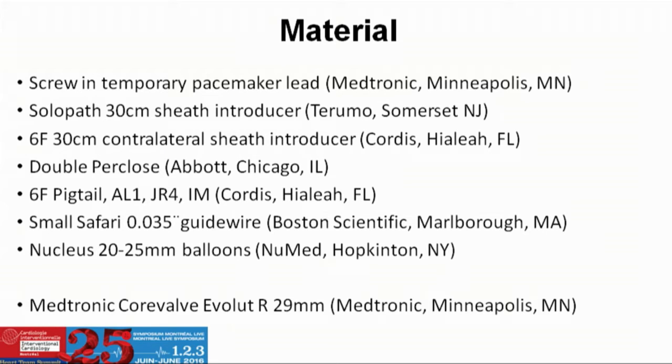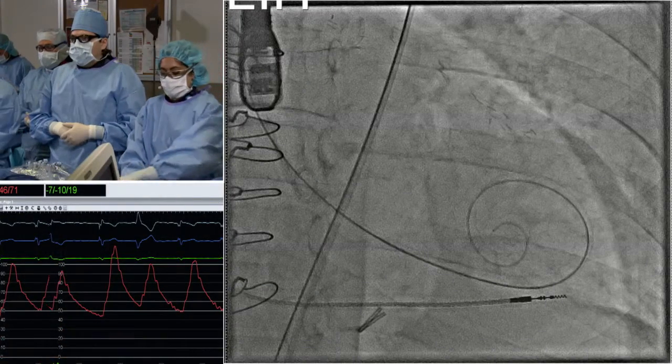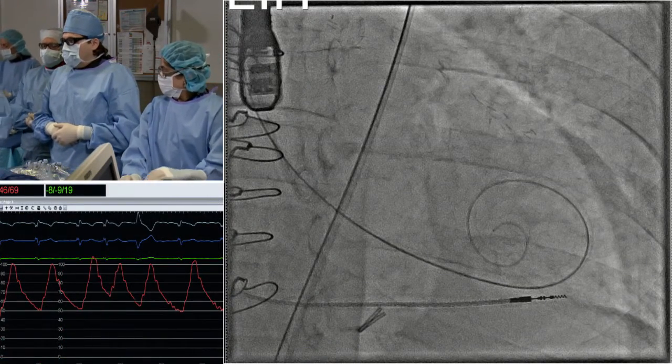And then the question was whether or not we're going to pre-dilate. And I see there's a bit of diverse opinions in the room with you guys. We personally chose, for the same reason, not a lot of calcium in the leaflet per se, not to pre-dilate. So we're going to go ahead with the valve, and that's where we're at right now. Yes. Okay, take the valve.